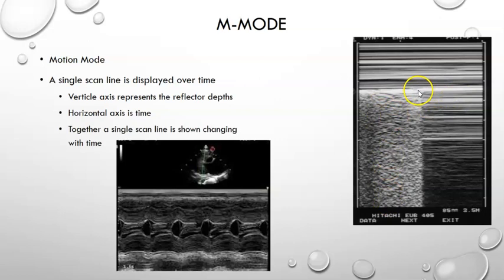And then we get to a point where instead of seeing the lung tissue behind the M-mode, if the patient lets out their air, the lung moves up and there's a pneumothorax. So the pneumothorax has moved into view over time. And so we can see in time exactly the point where patient breathing is showing a pneumothorax. And this pneumothorax is just more reverberation echoes. We'll talk about reverberation echoes eventually.